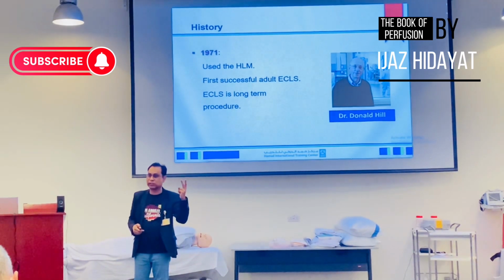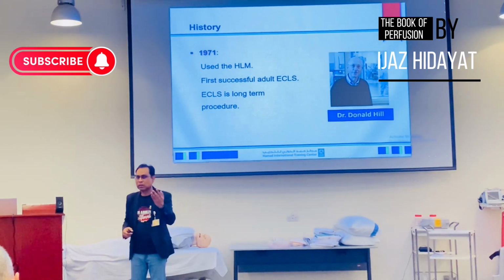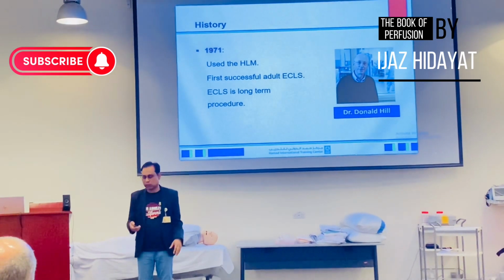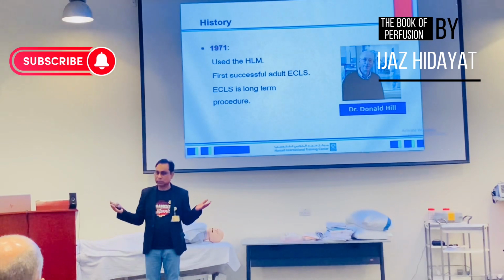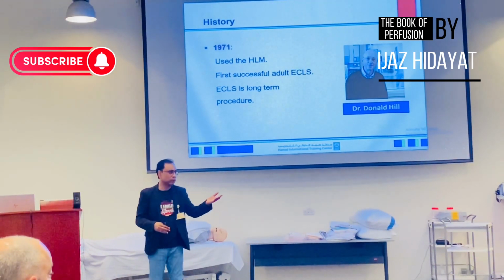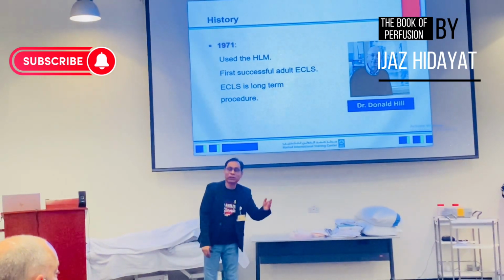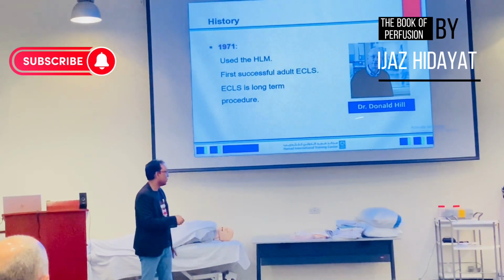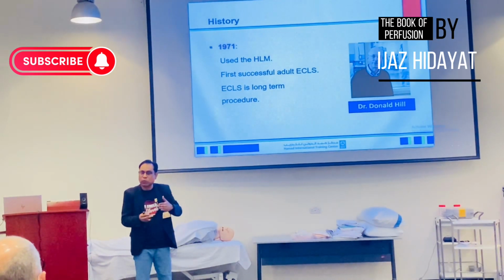There are two types of procedures, short-term procedures and long-term procedures. Which one is the short-term? The bypass surgery. The short-term is only for 3, 4 hours, maybe maximum 8 hours. But the long-term can go for a couple of weeks, even a couple of months nowadays. We experienced 8, 9, 10 months for the bypass. So huge. 330 days. How much? 330 days. See, a huge number. But this is not possible. But this is the beginning of how we moved to ECMO.